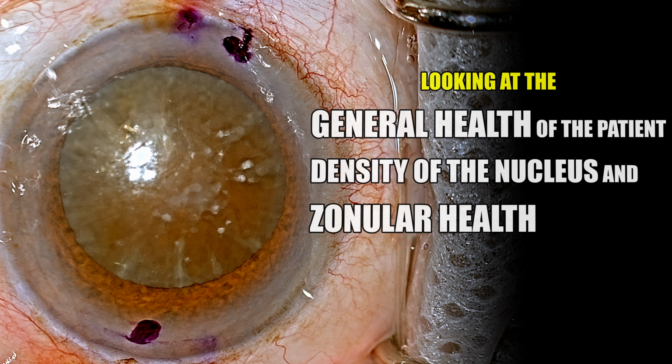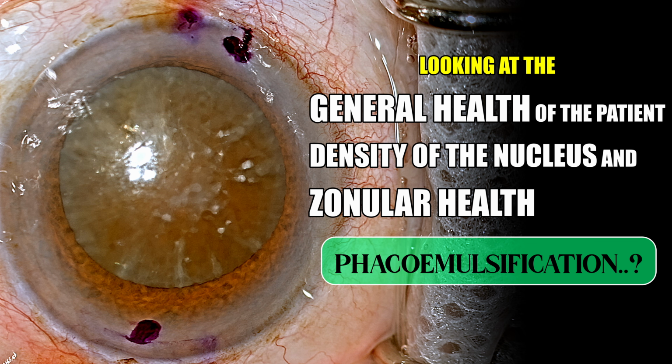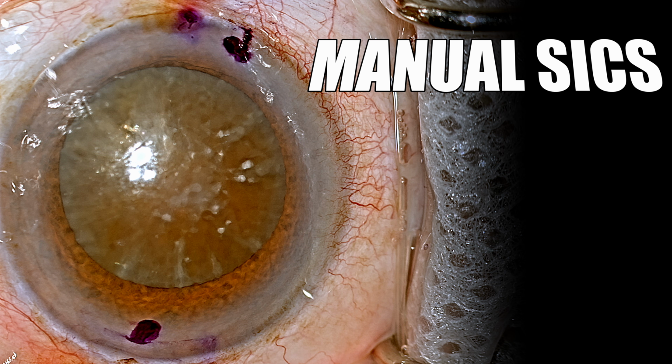But looking at the cataract and the general health of the patient, I was not sure of doing phacoemulsification simply because my major concern was the zonular health in this patient and also looking at the density of the nucleus combined with a weak bag. So I was not sure whether the phaco was the safest option. So I decided to do manual small incision cataract surgery.